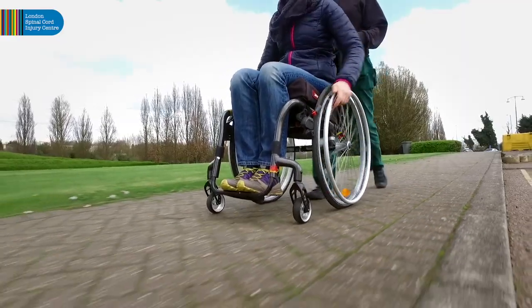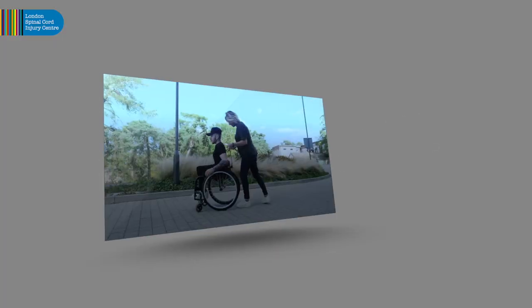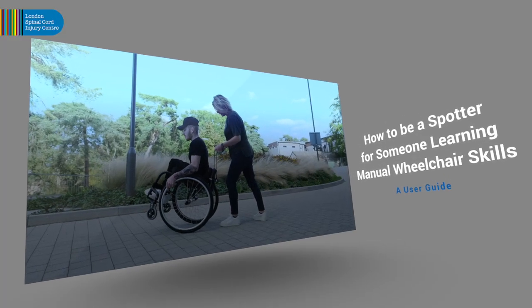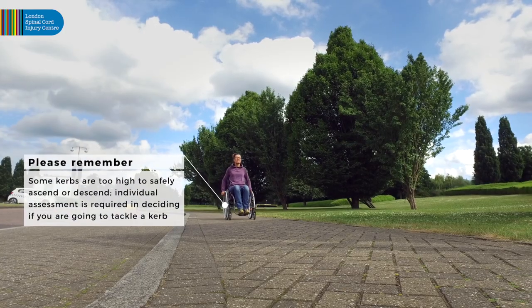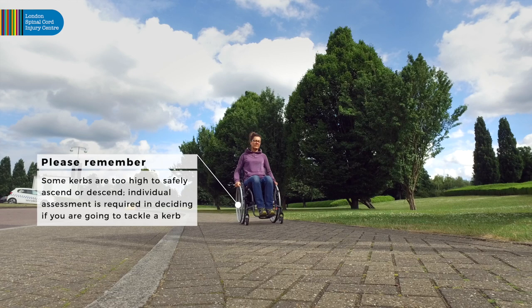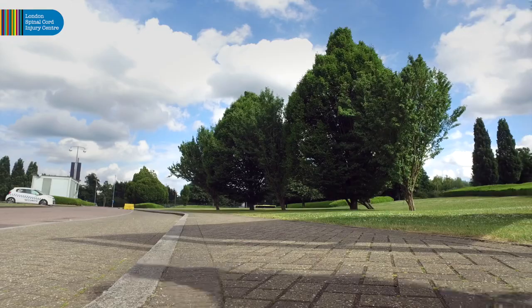When learning wheelchair skills, it is recommended to have a spotter — someone behind you to help you. See our video on how to be a spotter for someone learning wheelchair skills. Please remember, some kerbs are too high to safely ascend or descend. Individual assessment is required in deciding if you are going to tackle a kerb.